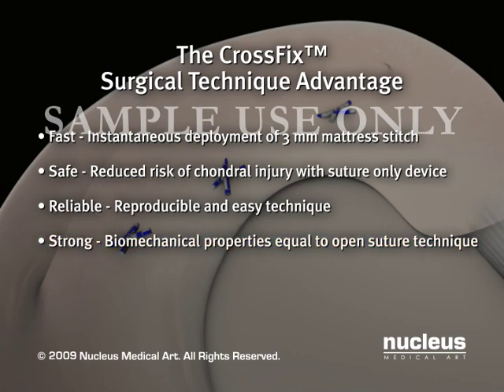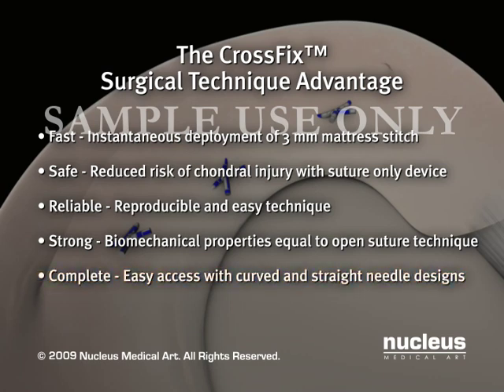The device provides biomechanically strong fixation with pull-out forces equal to open suture techniques. Straight and curved delivery needles allow for easier access to multiple tear sites.